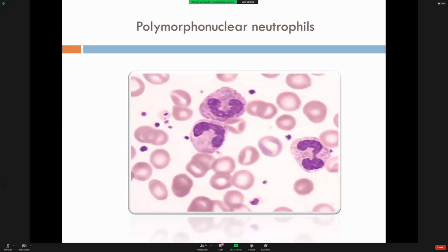What do you think? Polymorphonuclear neutrophils, hyposegmented. It could be hyposegmented. ممكن أحد يقول لي هذا this could be bands. إذا هنا neutrophils تكلم على neutrophils. غير مطلوب أنك تحفظ لي الباندز، تعرف الباندز لكن غير مطلوب أنك تفصل لي فيها. Neutrophil it's enough. This is a platelet.